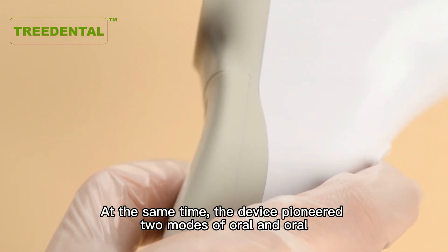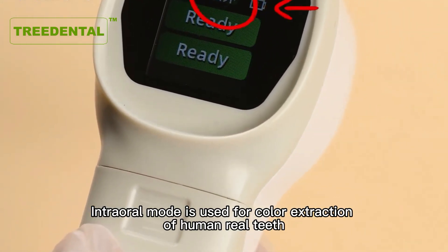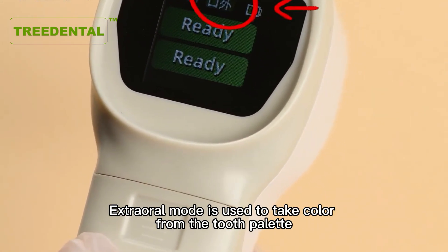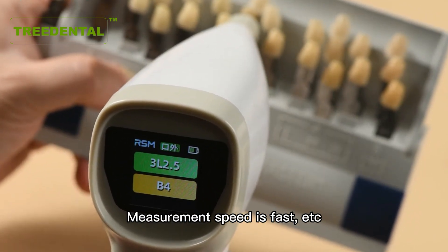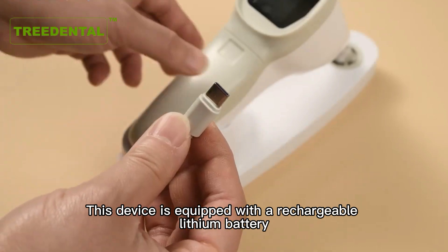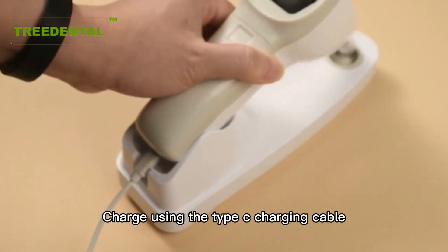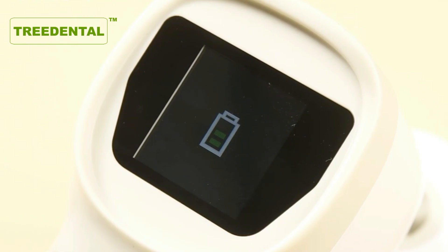The device pioneered two modes of intraoral and extraoral. This device is equipped with a rechargeable lithium battery. No need to replace the dry battery frequently.